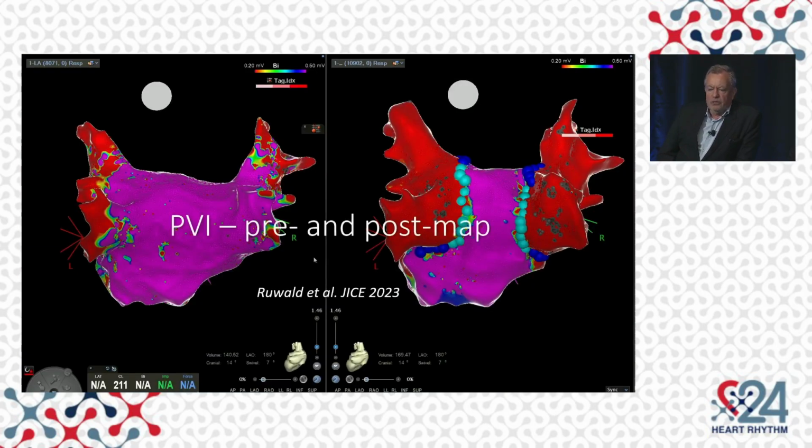With this, you can do pulmonary vein isolation de novo, obviously. This is a point-by-point procedure, so not much faster than an RF ablation. But what you get is a very high rate of first-pass isolation, be it PVI, and you avoid almost contiguous lesions on the posterior walls. It's like you sometimes see with single shot, promoting roof-dependent flutters.